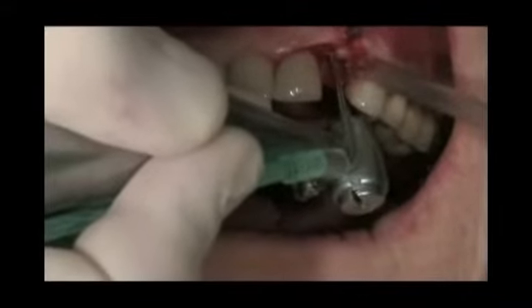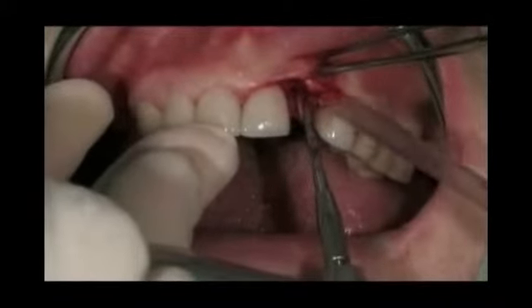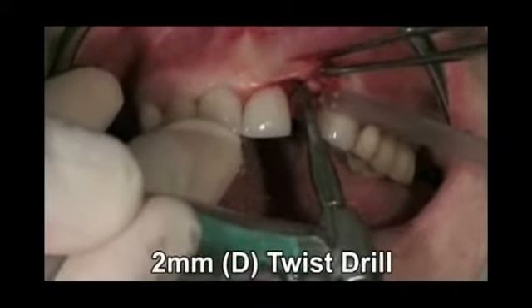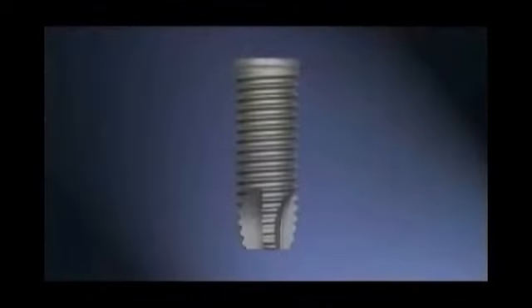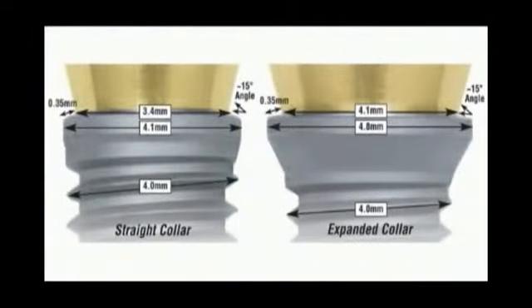After initial penetration of the bone crest, a 2 mm diameter twist drill was used with copious amounts of irrigation. Preparation of the osteotomy continued as described shortly, following the manufacturer's recommended protocol for placement of a 4 mm body, 3 mm platform diameter by 15 mm length NanoTite Prevail implant. The straight collar configuration was chosen rather than the expanded collar implant design to maximize the potential to preserve the crestal bone height, especially on the buccal aspect, and to manage the smaller restorative space in the maxillary lateral incisor region.